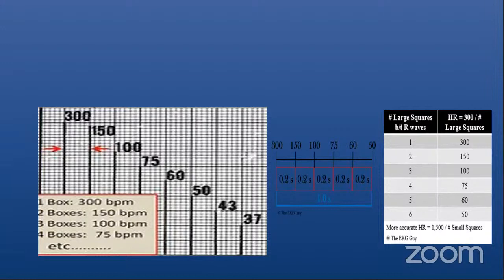Yeah. In relation to the rate, yes. In relation to sometimes the P wave axis, yes, you can. But obviously, to have the full information, you need a 12-lead ECG. But for developing countries, if a unit hasn't got an ECG facility at all, then yes, from the monitor you can just print out that lead 2 and have a look at whether it is sinus, a normal rhythm or not, or whether there are some abnormalities. But really, if you want to know the ECG, you need a 12-lead ECG.